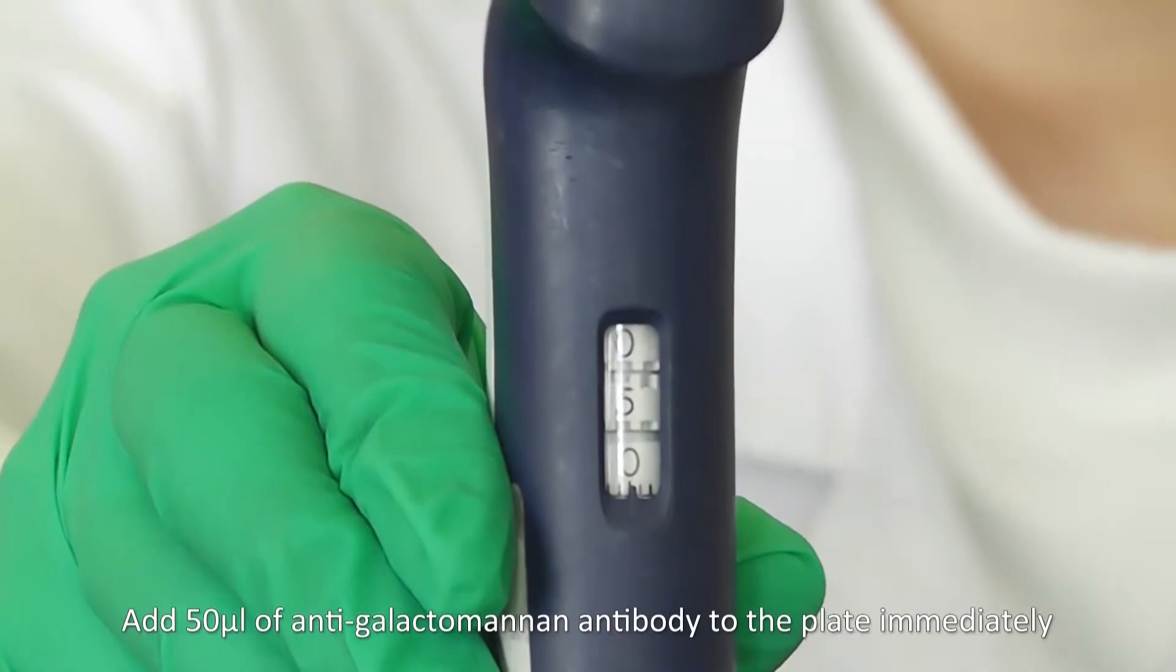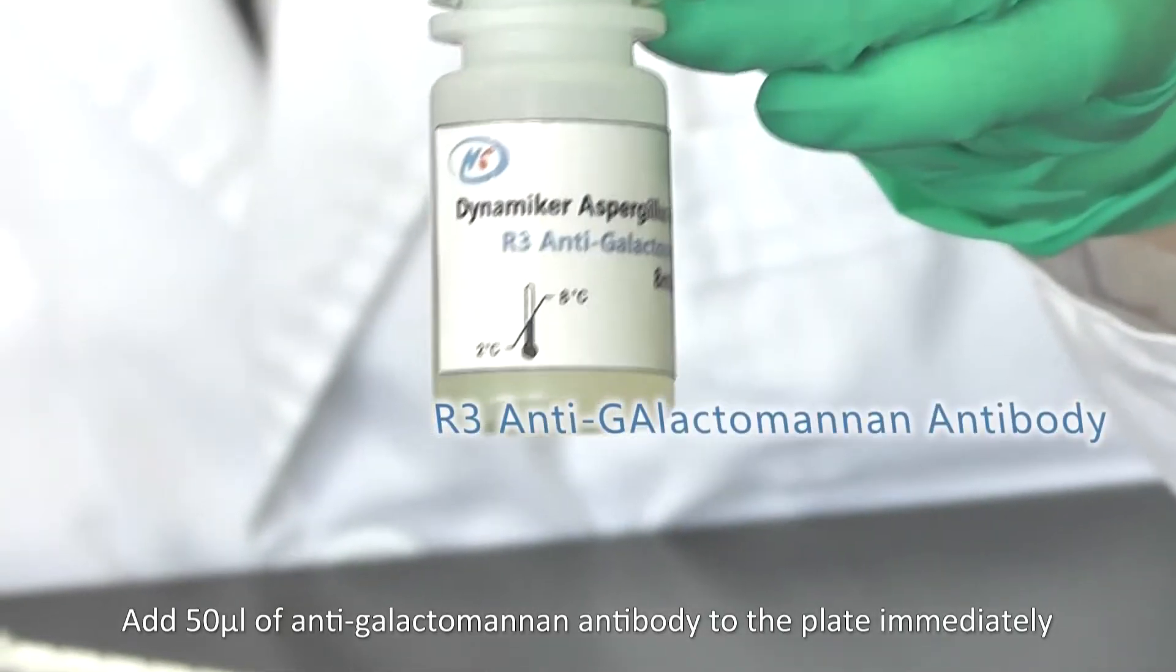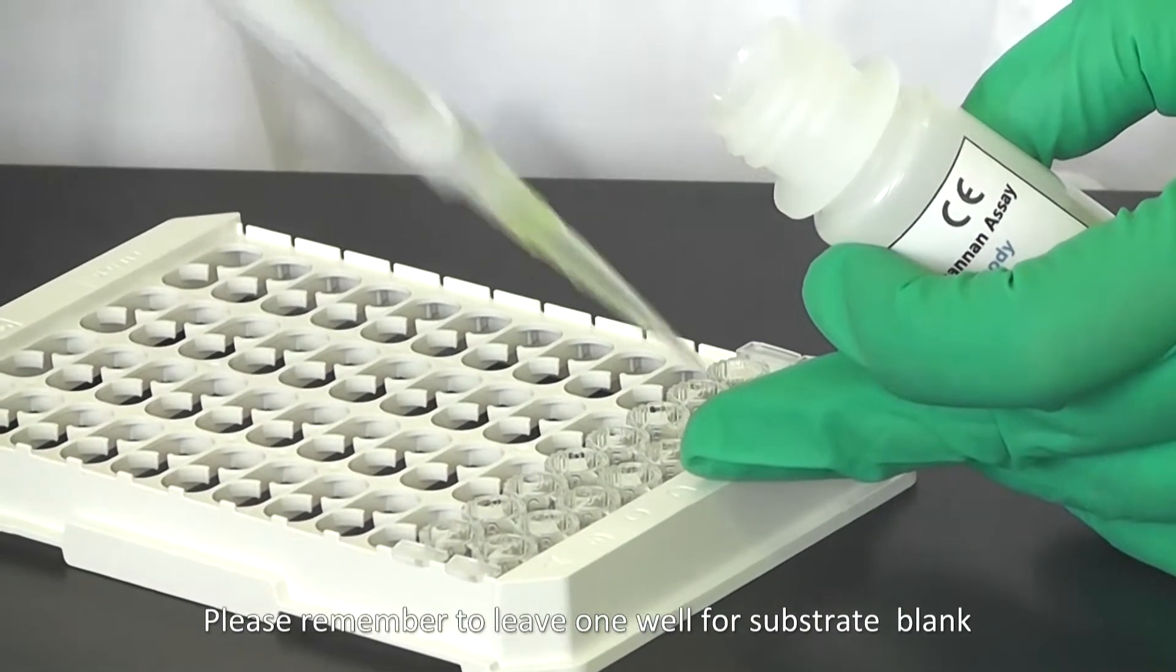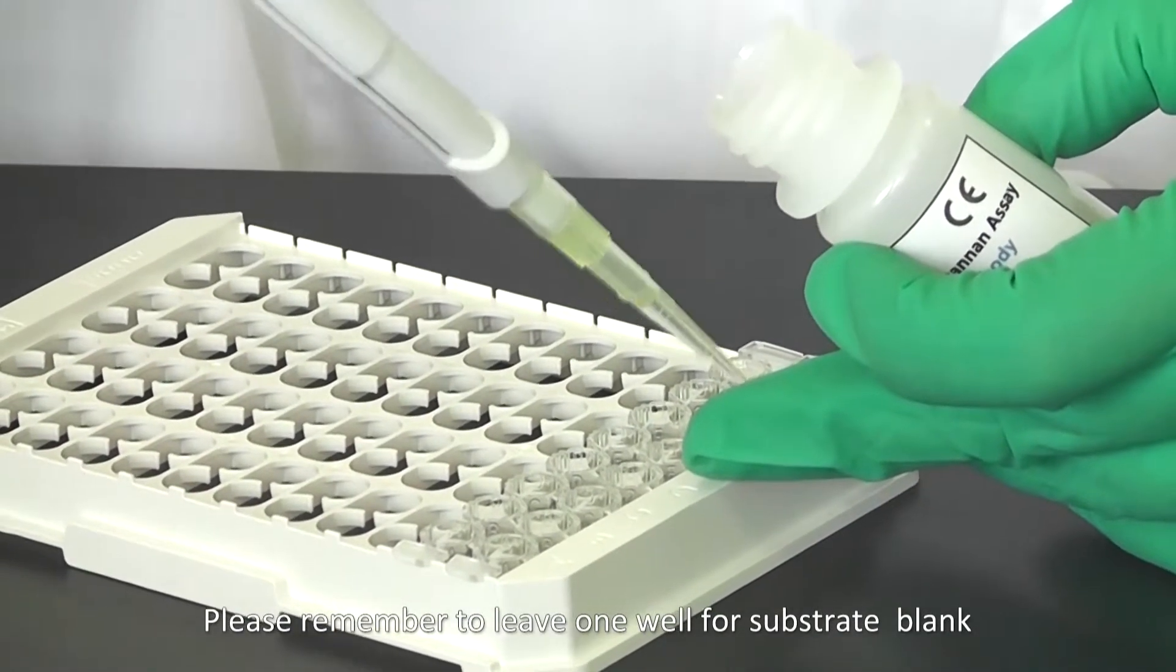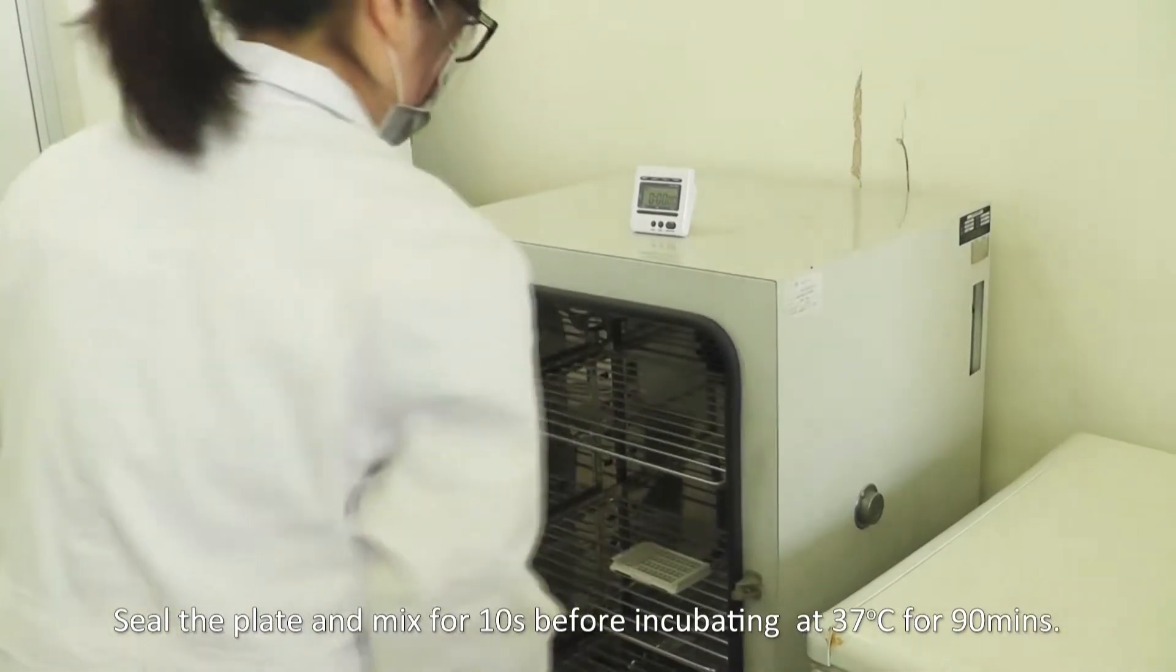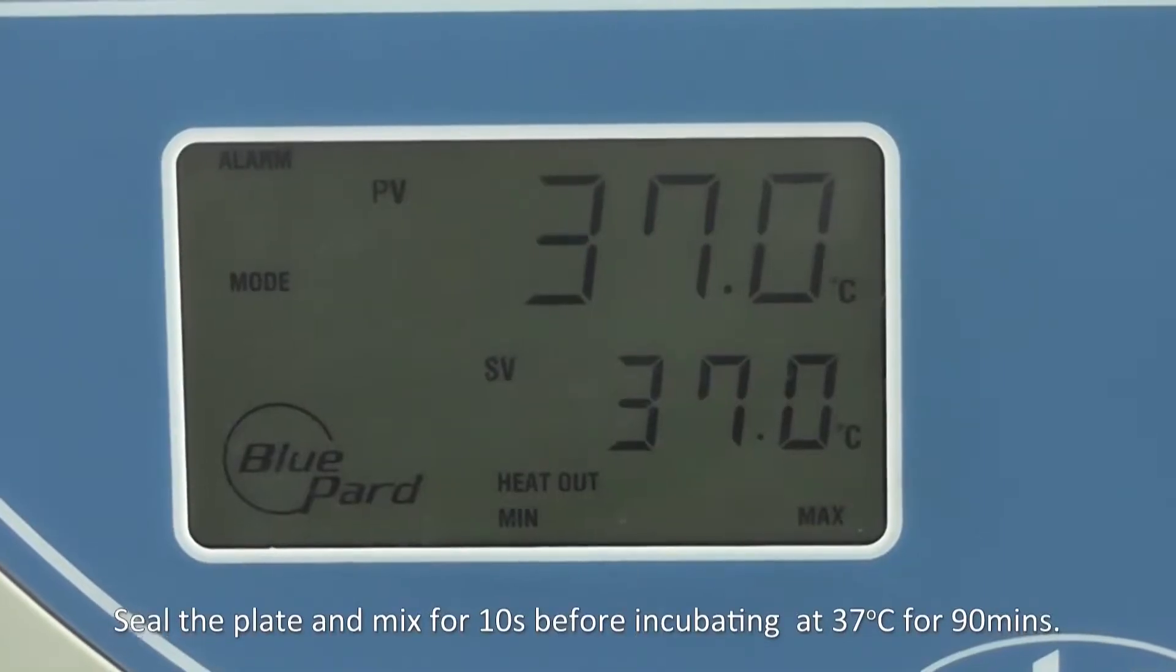Add 50 microliters of anti-galactomannan antibody to the plate immediately. Please remember to leave one well for substrate blank. Seal the plate and mix for 10 seconds before incubating at 37 Celsius for 90 minutes.